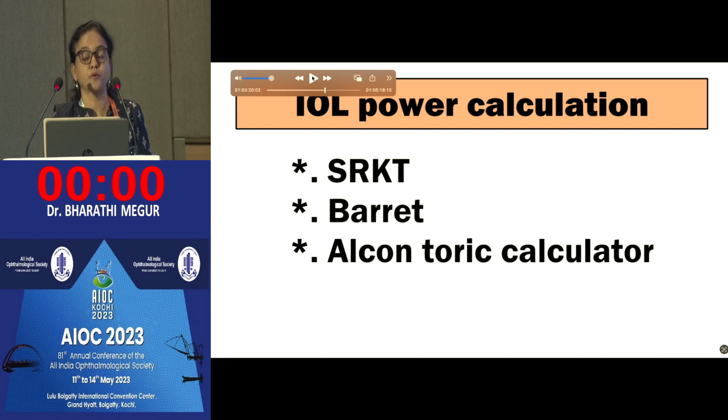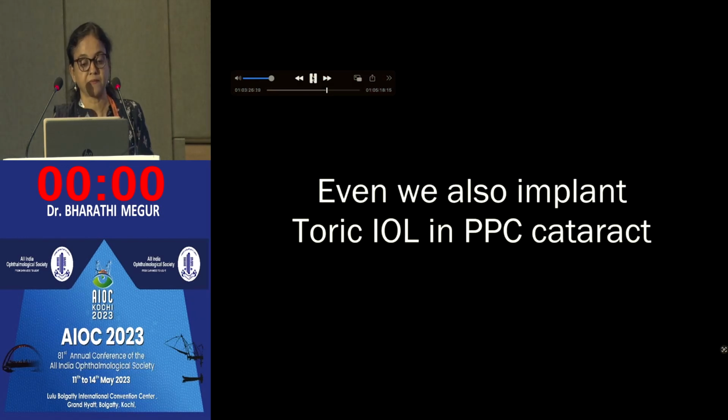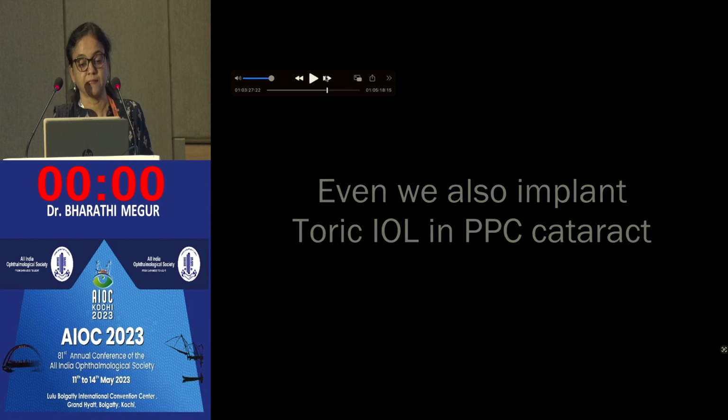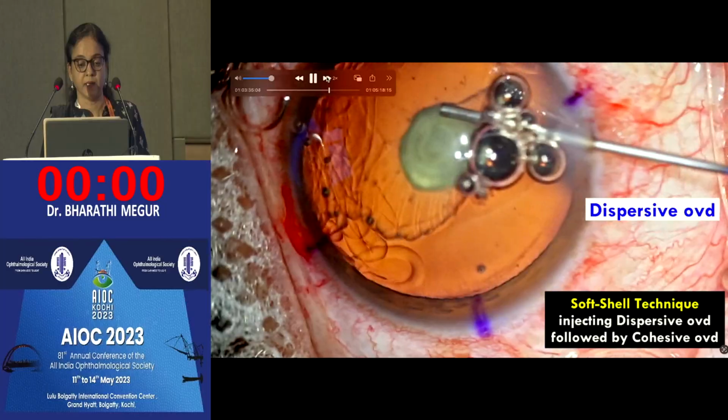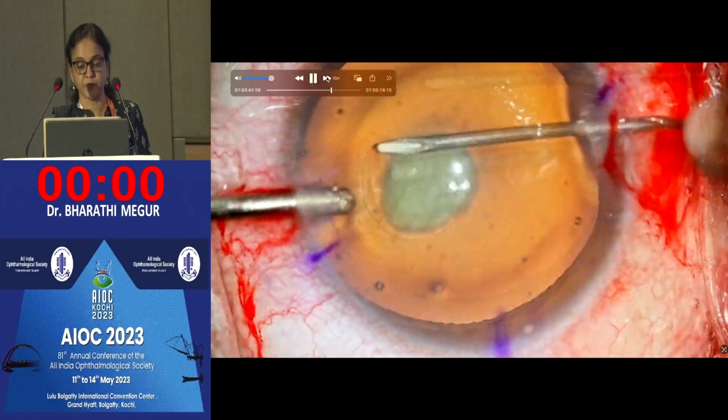Suppose you would want to choose an Indian IOL, the Indian manufacturers themselves have their own online calculating devices through which they would be providing you the sheet for implanting the IOL, including the axis to be implanted. So we have Acreol and Biotech, I think. These are the companies where we do get IOLs from Indian companies. Let me rush through this video.